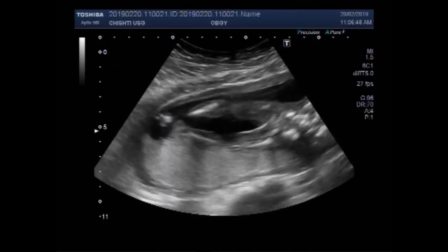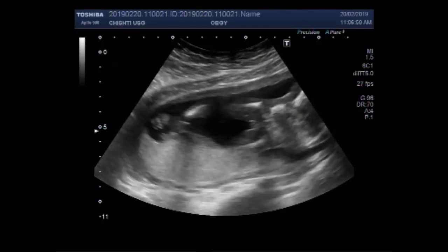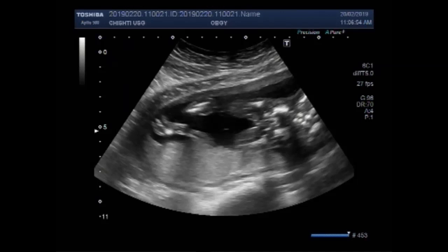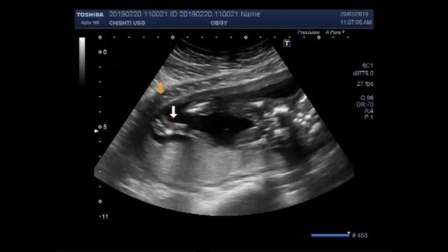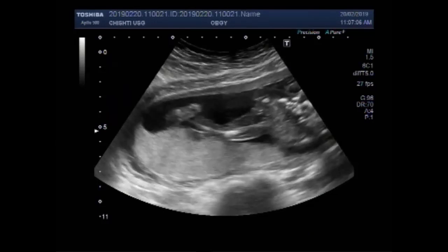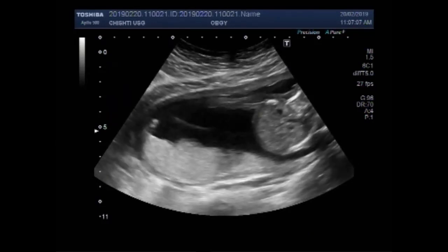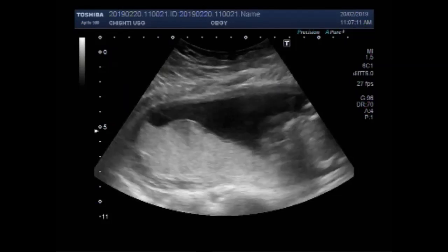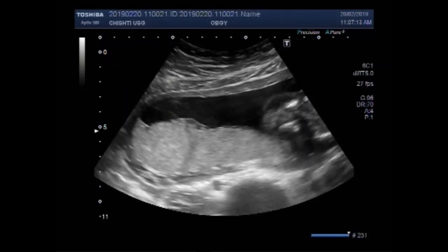You can see both the legs, and these look to be echomorphologically normal. This is the foot. This is the placenta, which is posteriorly attached.